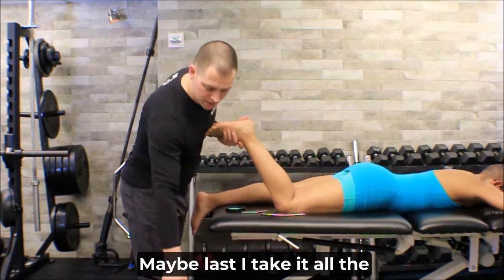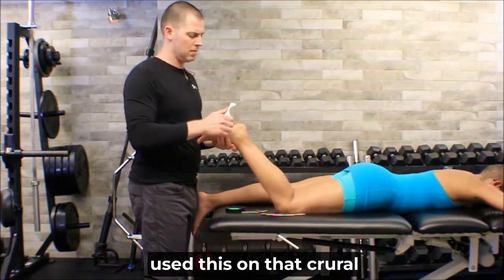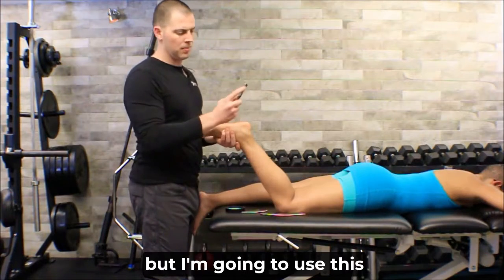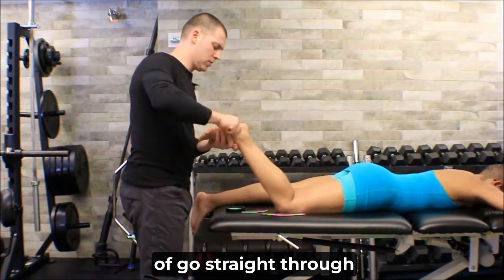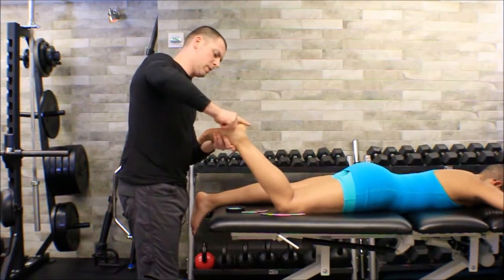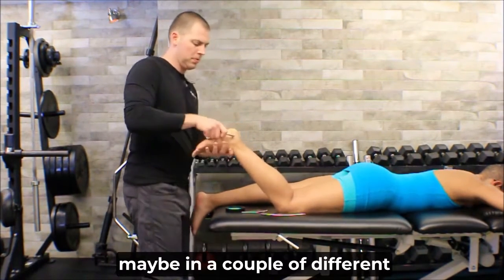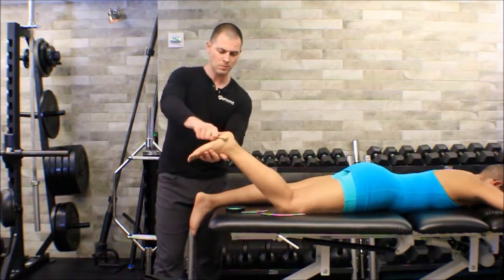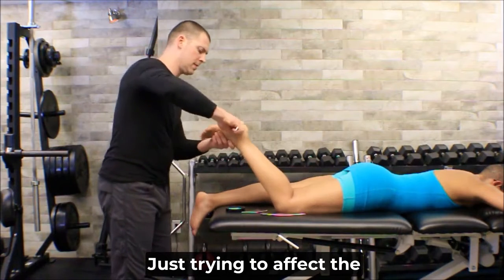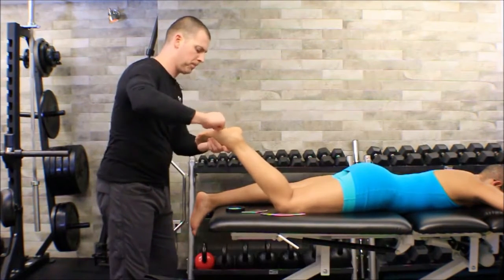And maybe last, I take it all the way up to the heel, and we used this on that crural fascial video, but I'm going to use this smaller curve here and just kind of go straight through the heel, maybe in a couple different directions. Just trying to affect the plantar fascia as much as I can.